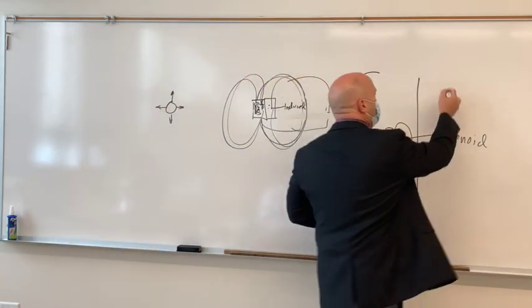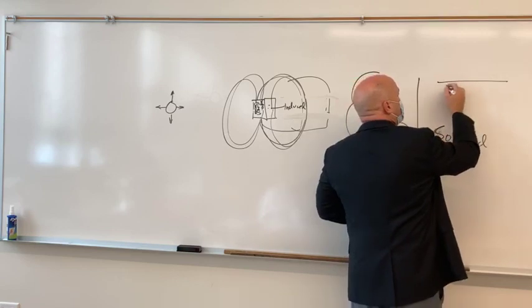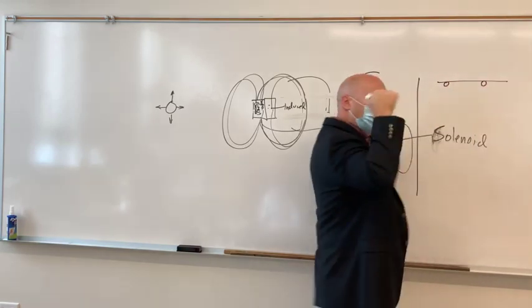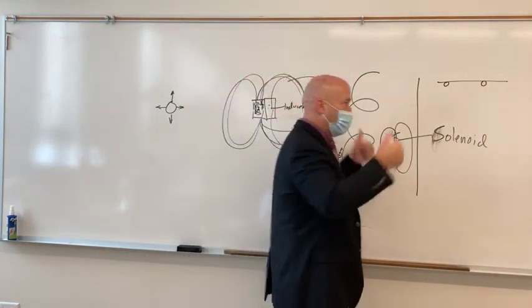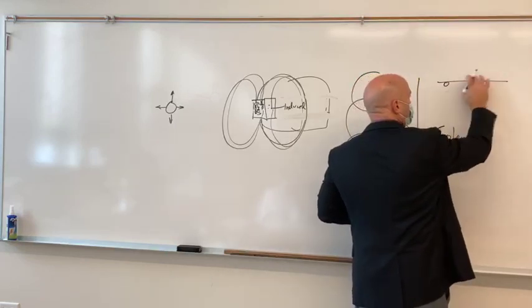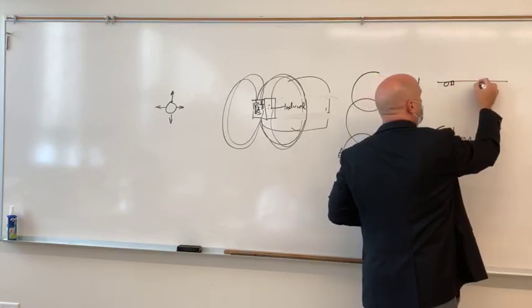So on your tower, what you've got essentially is rails up into the ceiling, and then you've got these rollers that your tower rolls on. The same thing happens when you extend either up or down your tower. It's rolling on these rollers, and it's got a brake that mashes into the rail.